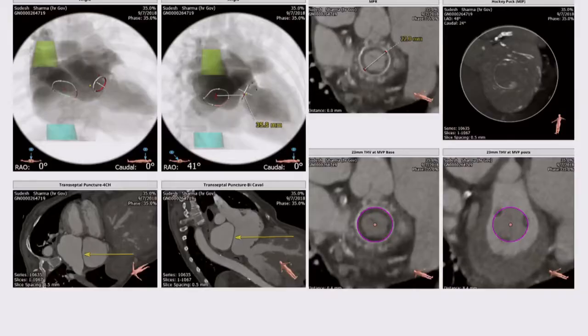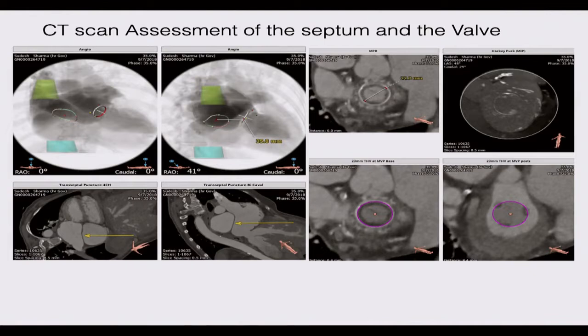Our plan was TMVR valve-in-valve with a Sapien, transeptal ASD closure if required, and staged caval valve implantation. CT scan assessment is very important for mitral valve interventions. We need to look at the neo-LVOT, the interaction of the mitral valve with the aortic valve and LVOT, and the anterior mitral leaflet — though for a valve-in-valve procedure the anterior mitral leaflet is already resected. We also assess the septum in relation to the plane of the mitral valve.